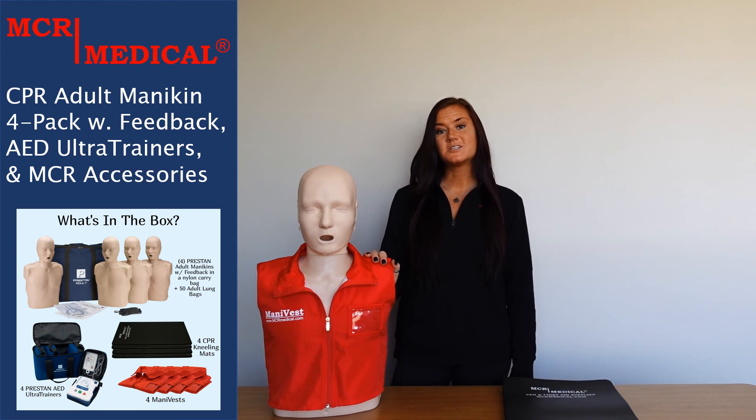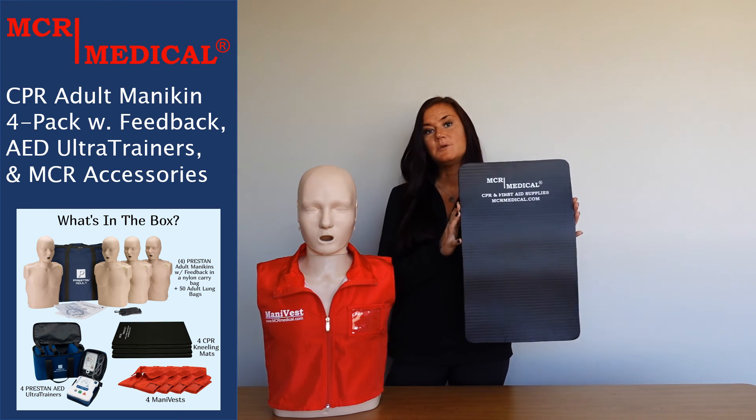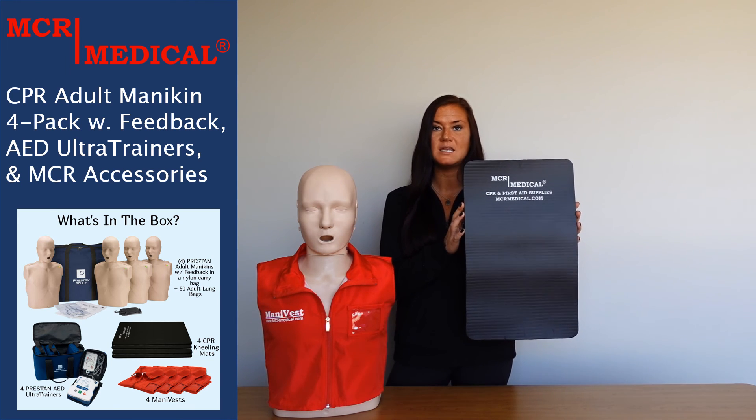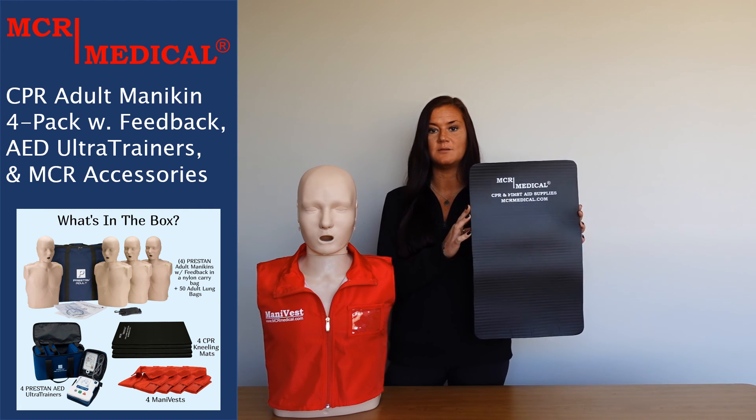Last but certainly not least are the MCR Medical CPR kneeling mats. The CPR kneeling mats have a large surface which will help to reduce knee pain, lower back stress, and reluctance on the student's part to practice CPR in a kneeling position.